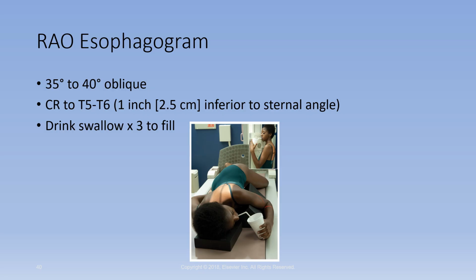I will tell you, if they're upright, then that position is a lot easier on the patient, but it would be more challenging for us to get the esophagus full of barium. So if the patient is standing up, it's a lot more difficult for us to get the images that we need, but it's easier on the patient. I will be honest and tell you, I have never done an esophagram upright. I have always had the patient lying down like she is here in an RAO.